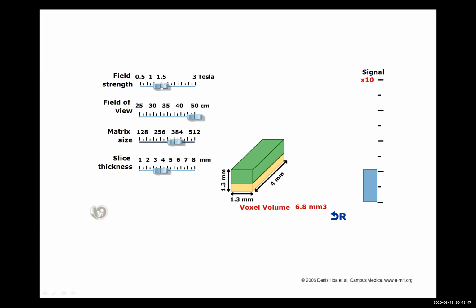As we agreed, field strength is the first tool to have when you want to do high resolution. So for example, if you have a clinic or a hospital that's interested in, let's say, ENT, or a small high resolution sport center, they usually want to see very tiny details. So we will advise them to go for 3 Tesla because they need to see very small details and very high resolution. While in 1.5, as you can see, signal will drop accordingly. Let's say we have 1.5.